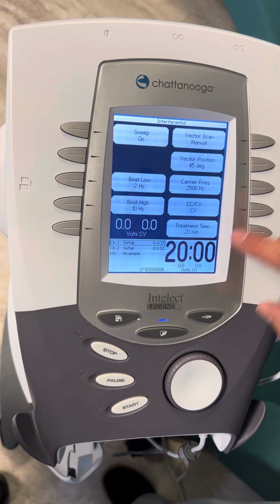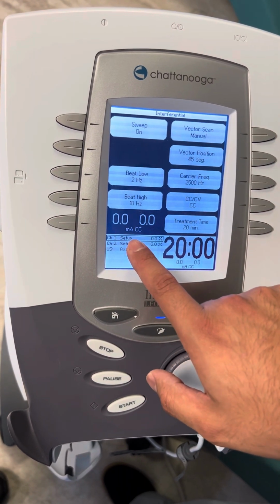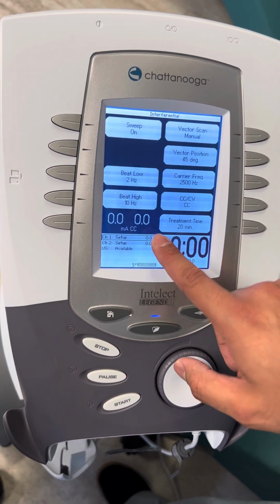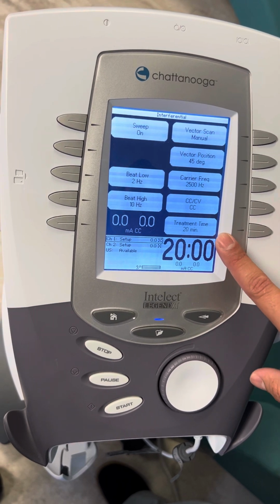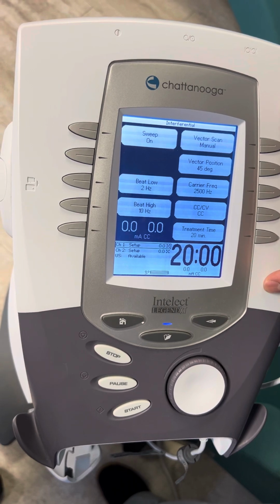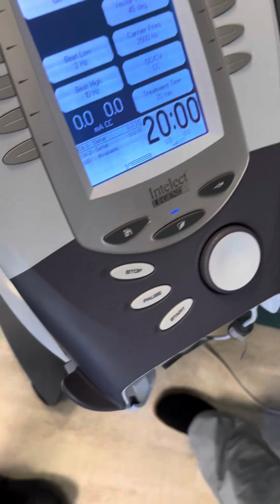Cool. And then the other thing that will change is this, just so the milliamps would appear. And that would be considered for the intensity of the treatment. Right? The treatment time can stay at 20 minutes for now, since I'm just going to show you guys how to place it. So once we are placing it, I'm going to go ahead and use myself as an example. We're going to have some electrodes here, place them.